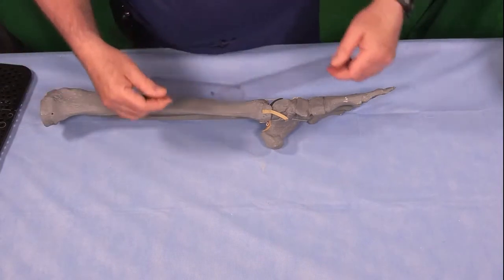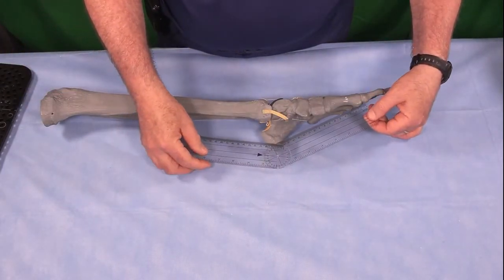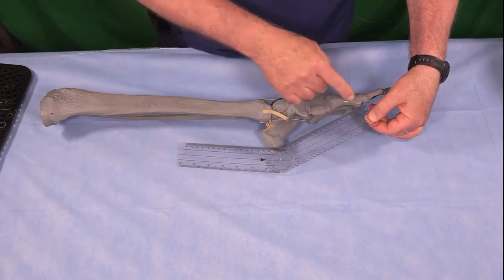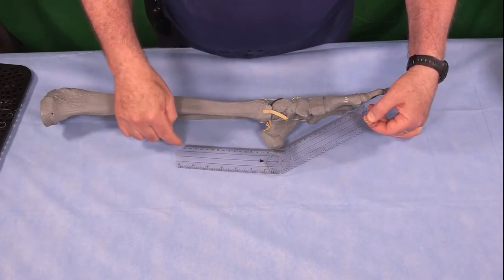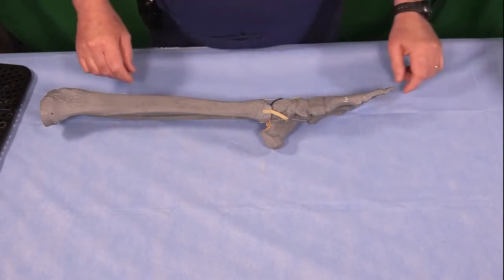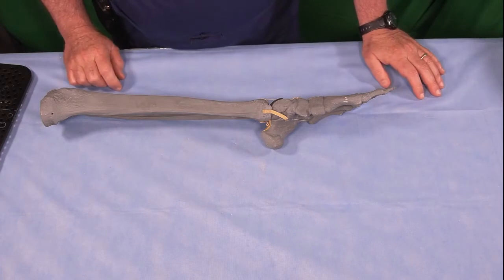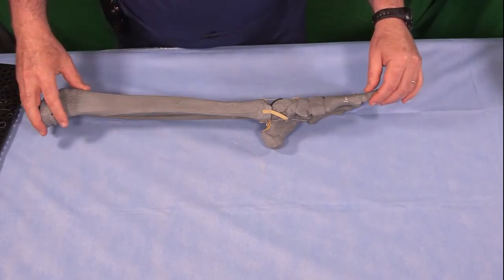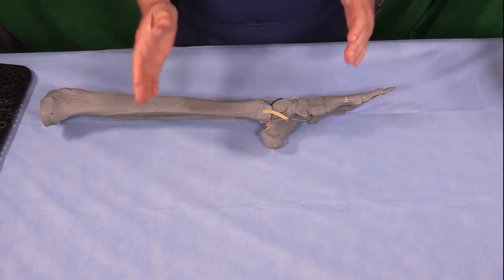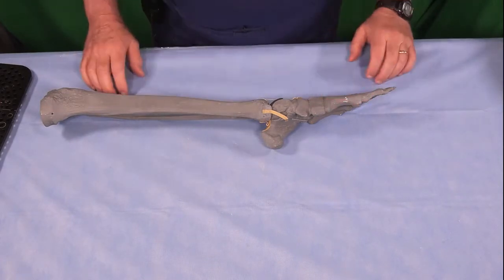Now how do we measure that? We'll measure from the plantar surface of the foot, so I'm measuring from the tuberosity of the calcaneus, the first metatarsal, relative to the tibial shaft, and I'm getting about a 60-degree Equinus. So that's a lot of correction, and you'll see as we continue on why that becomes important and what tricks I can share with you on how to get out of this very strange situation.